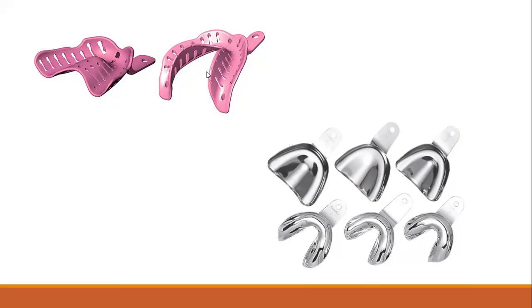Here it's a metal tray. These are plastic trays. These are metal. These are perforated. You can see them perforated. They will let the material go out from the tray while we're taking the impression, and we will talk about this later. But here, as you can see, it's not perforated. It's a metal tray. This for the upper arch and this for the lower arch. We use them for specific materials.